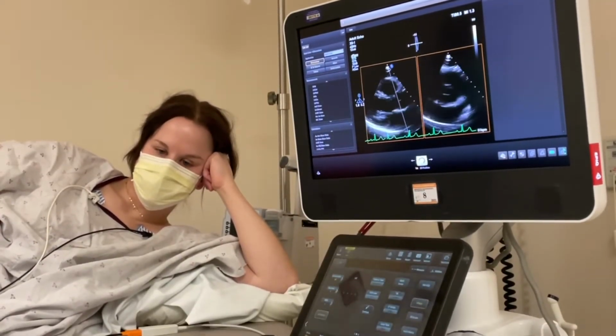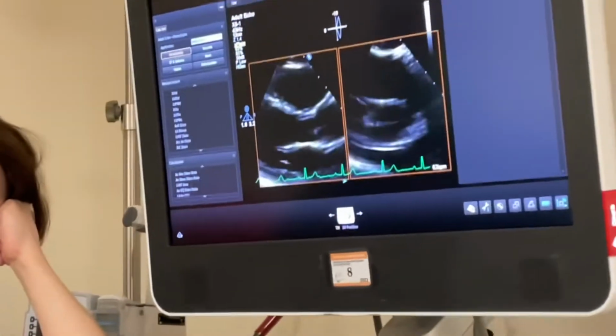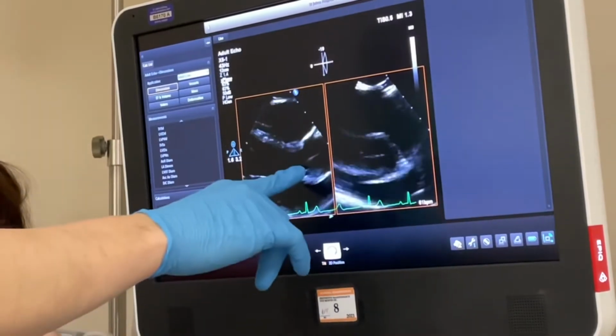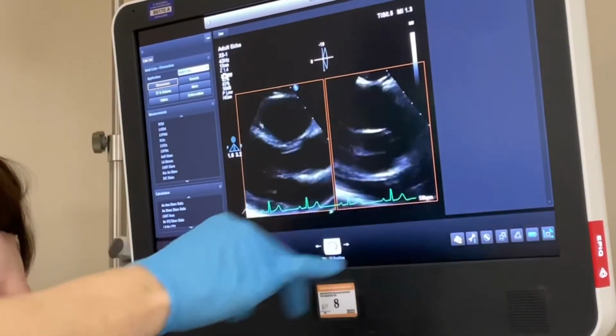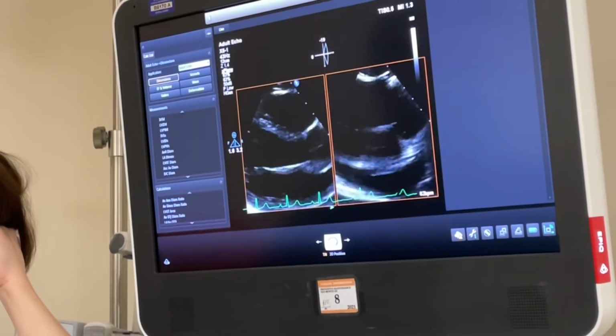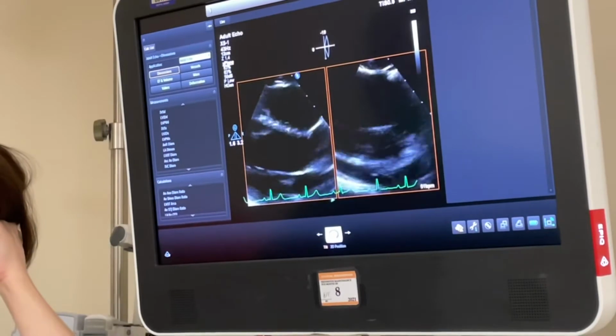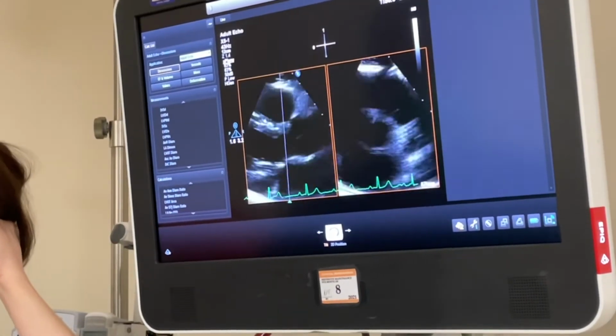So we can go up on our aortic valve. We'll zoom up so you can see both planes, a 90-degree difference of any anatomic features that we use. This is helpful with the transthoracic for doing the aortic valve. You can also do the mitral valve.